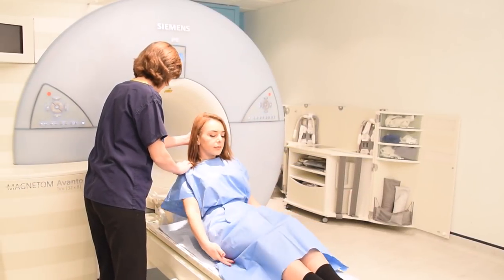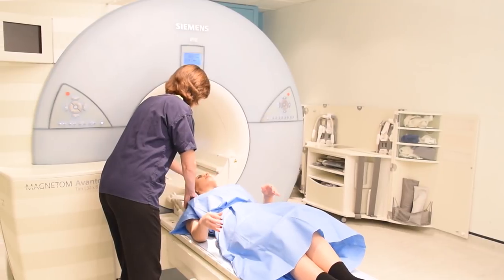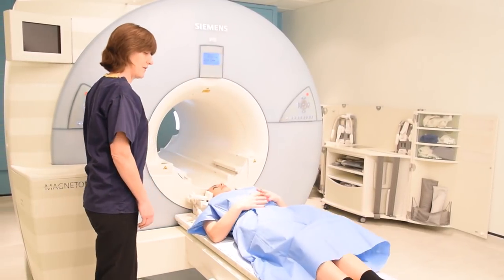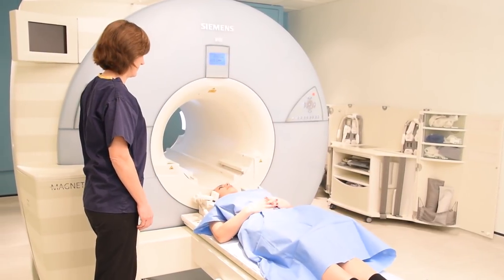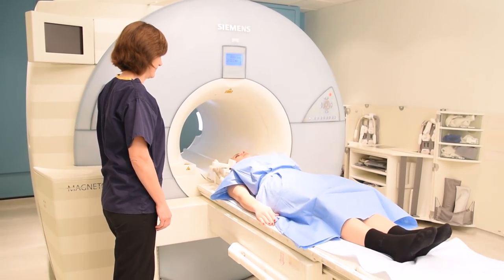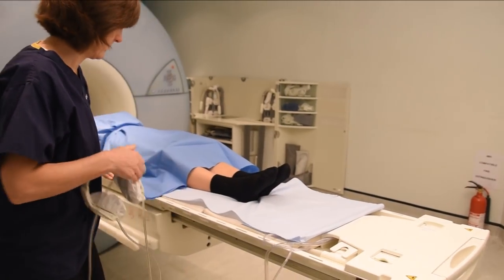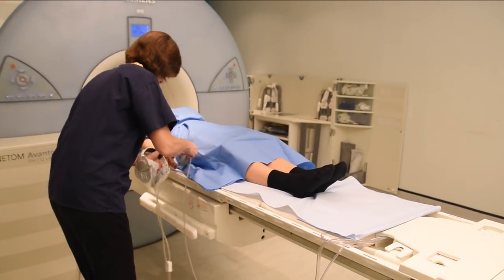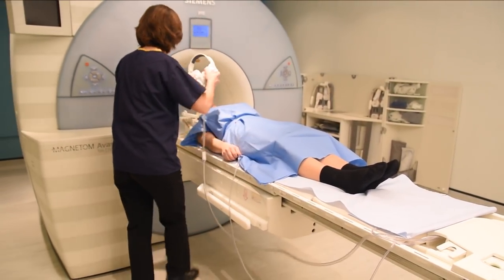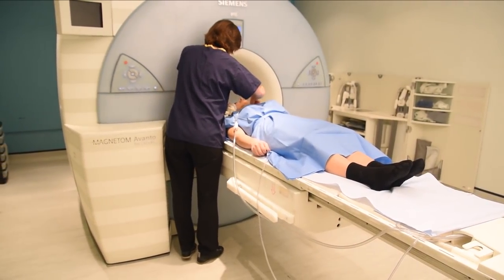Once the safety checks have been performed, ask the patient to lie supine on the bed with their head in the head coil. Give the patient an emergency alarm, making sure they know how to use it, and provide ear protection in accordance with the manufacturer's guidelines.